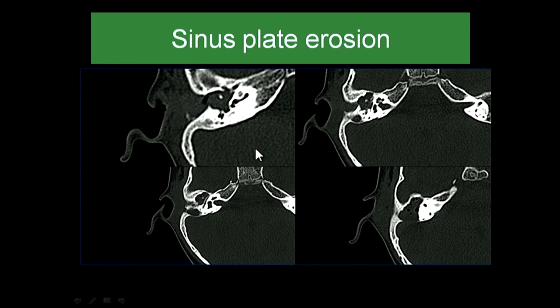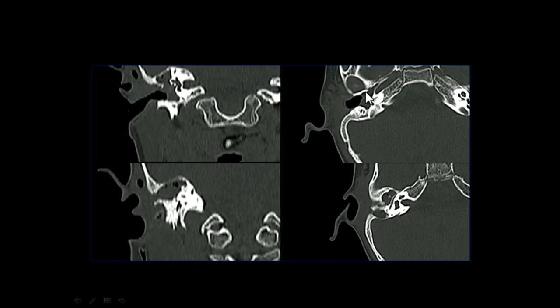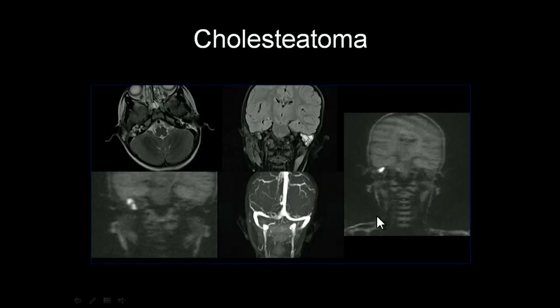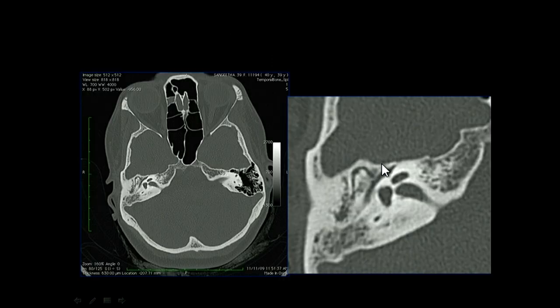Another patient — a child with discharge — shows sinus plate erosion with a defect, ossicular chain erosion, and tegmen thinning — all consistent with cholesteatoma. Because of the sinus plate erosion and thinning, we performed MRI including a venogram to confirm sinus integrity, and also non-EPI-DWI, which shows diffusion restriction confirming cholesteatoma. This was confirmed on surgery.